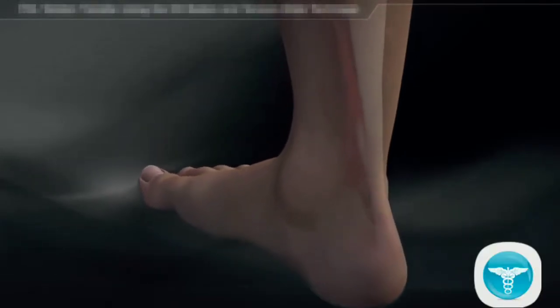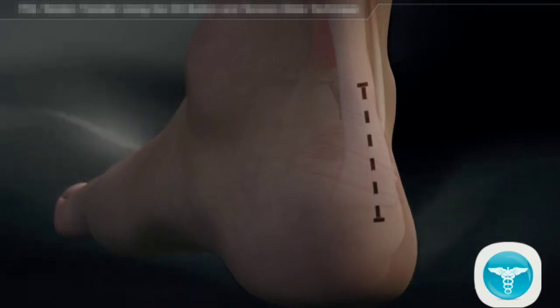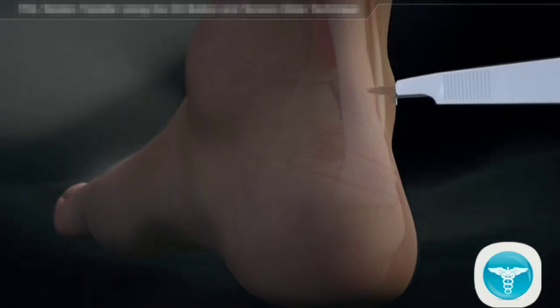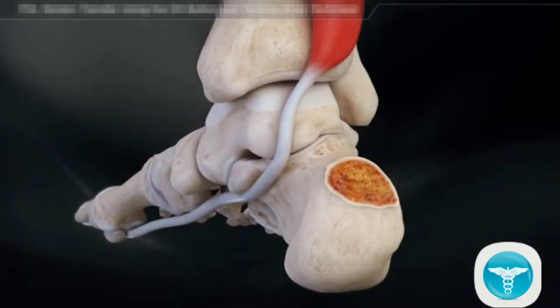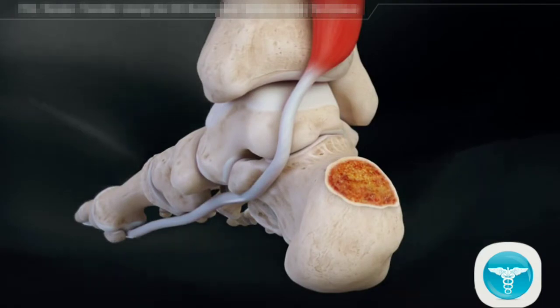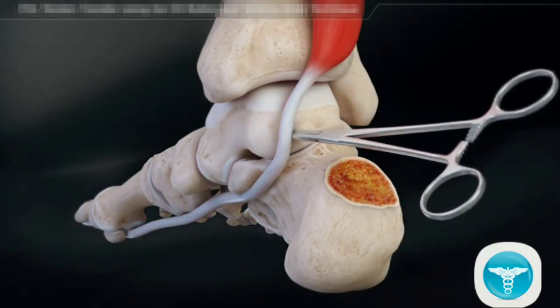Flexor hallucis longus tendon transfer with DX button and tension slide technique. Make a 5 cm to 7 cm longitudinal incision through the midline of the Achilles tendon. Use fine scissors to make the incision deeper until the FHL tendon and its muscle belly are identified. Confirm by flexion and extension of the hallux.